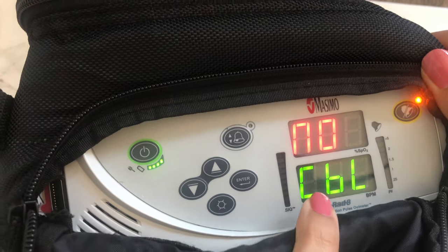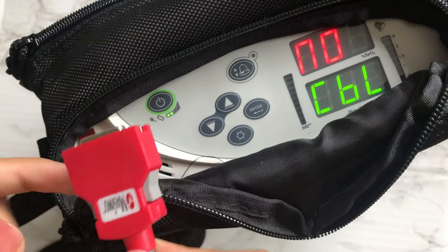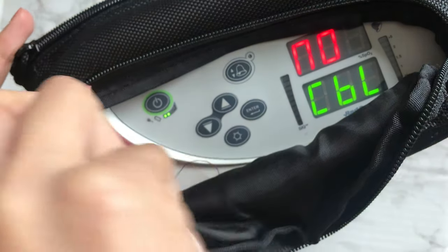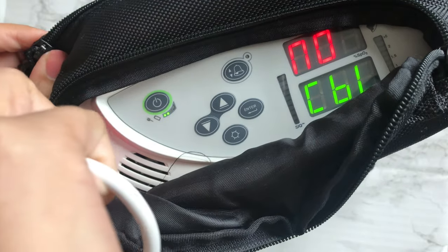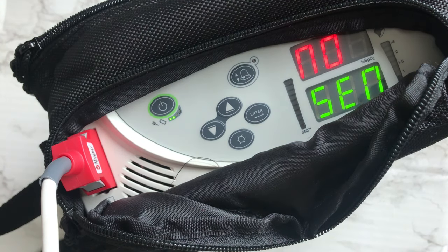A no-cable sign indicates the cable is not attached to the machine. Take the red cable and attach it to the front left of the interface, pushing it down firmly. Once attached, the display will change and now show 'no sensor.'